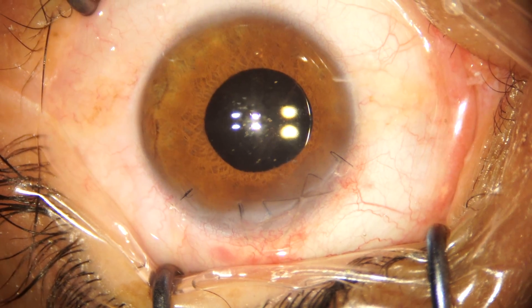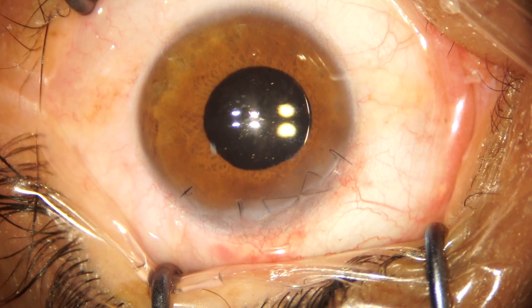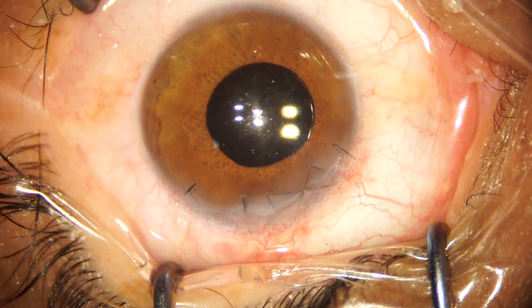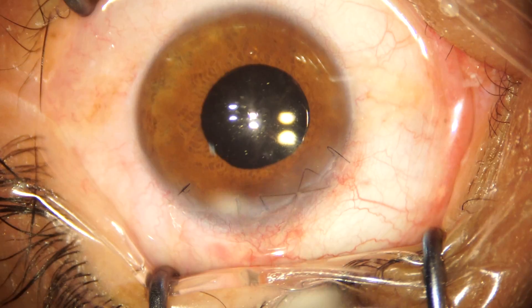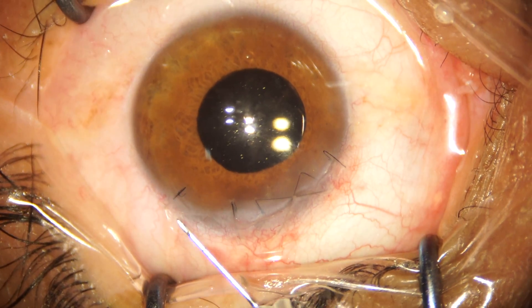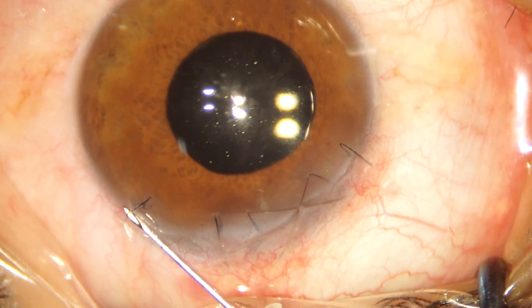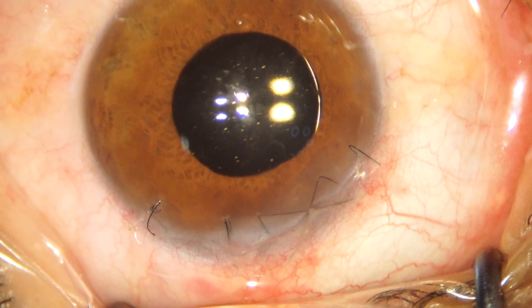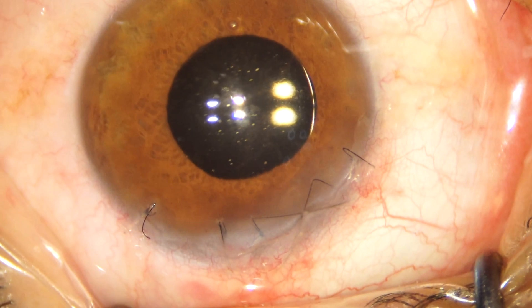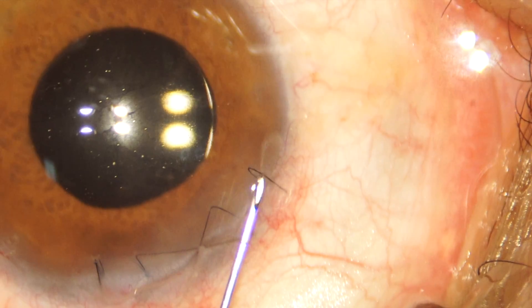Let's demonstrate this in the video in real time. Why this cataract surgery has so many sutures on the main wound is a topic for another video, but let's focus on the correct technique for suture removal. I'm going to take a 31 gauge bent needle, which is very atraumatic for the cornea. All the suture knots in this case are buried inside the clear cornea. With my 31 gauge bent needle, I go underneath the overlying limb of the suture and break it on the scleral side away from the knot. From the north side I pull out the overlying limb, and then I pull the suture out with the McPherson forceps from the clear cornea.